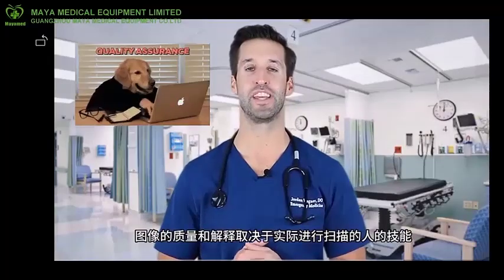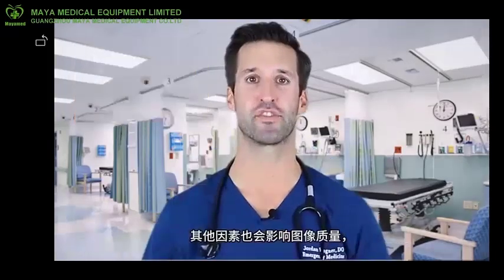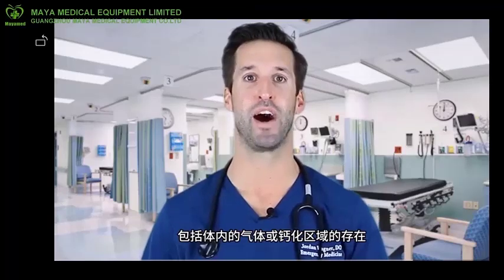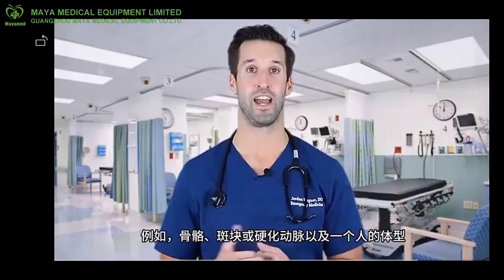Quality and interpretation of the image depends on the skill of the person actually doing the scan. Other factors can affect the image quality, including the presence of air or calcified areas in the body, for example, bones, plaques, or hardened arteries, and a person's body habitus or size.